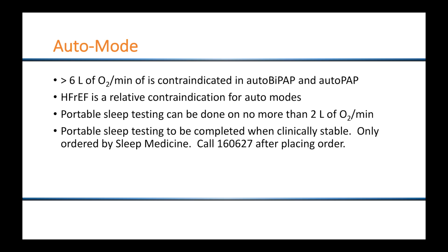Keep in mind there are contraindications to using auto mode. When a patient is on greater than 6 liters of O2, it's contraindicated to use auto modes such as auto BiPAP and auto PAP. Heart failure with reduced EF is also a relative contraindication for auto modes. Also note, portable sleep testing can be done on no more than 2 liters of oxygen. So if a patient is on 3, 4, 5 liters, a portable sleep study should not be completed.